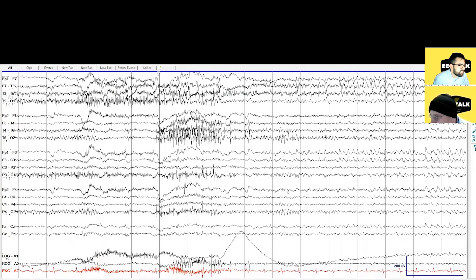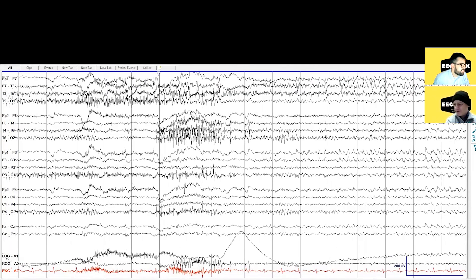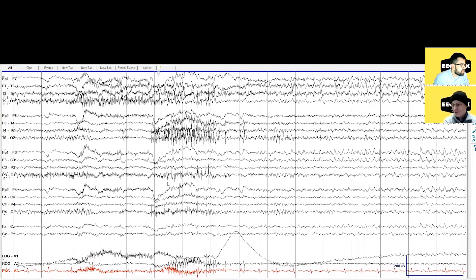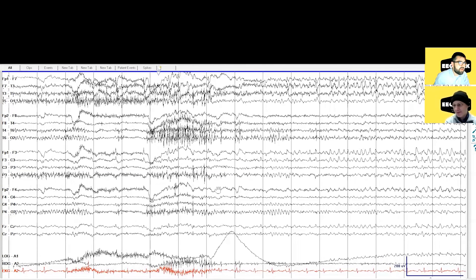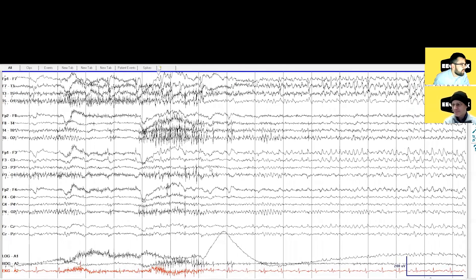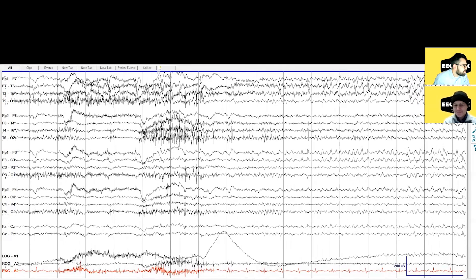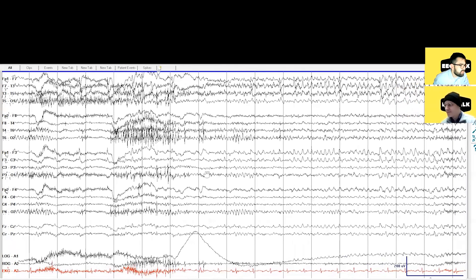Let's walk through this carefully. Did you watch the video? Actually, I got a report from the team and it seems like she had some spells last night. I can tell you a little bit after we look at the EEG. Looking at this now, on the left-hand side of the page, she had just woken up — we saw that PDR — and there's some muscle artifact until this rhythmic activity showed up here in the left temporal and left parasagittal chain.